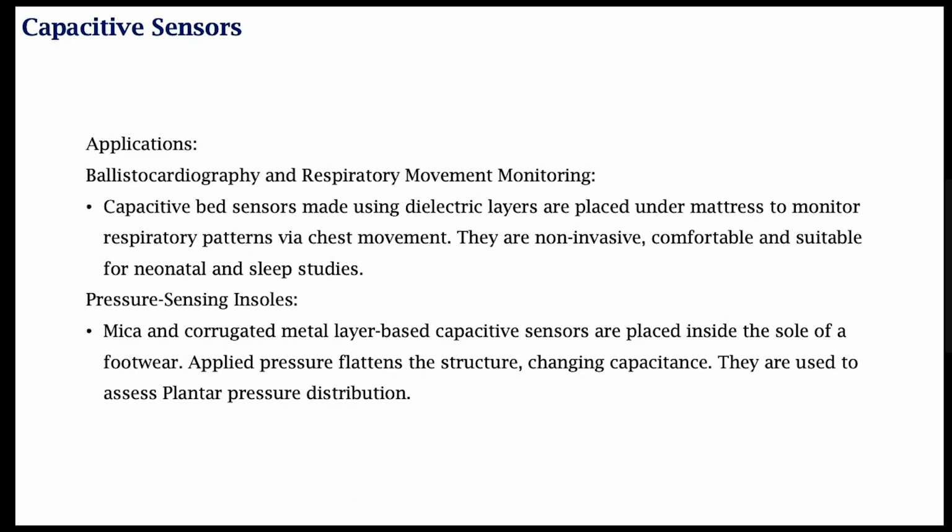In such cases, non-contact measurement is better than spirometry, because not in all cases can a patient actually breathe through a spirometer, because maybe they have other tubes going through their nose and mouth, for example, in an ICU setting.